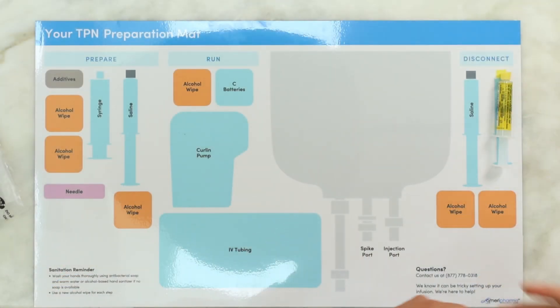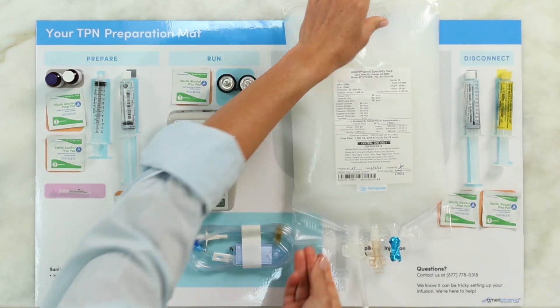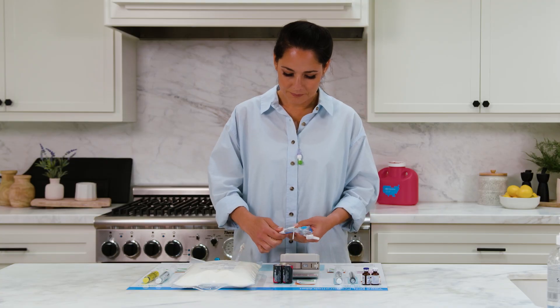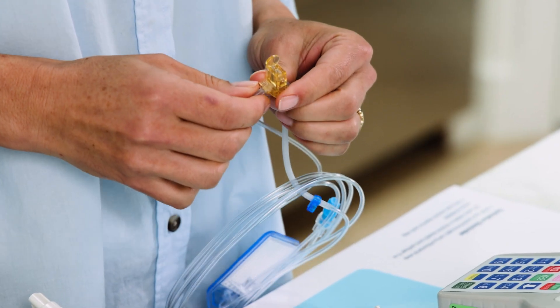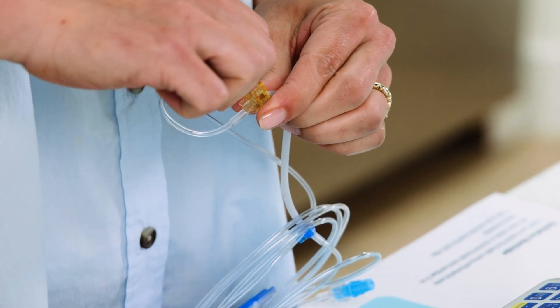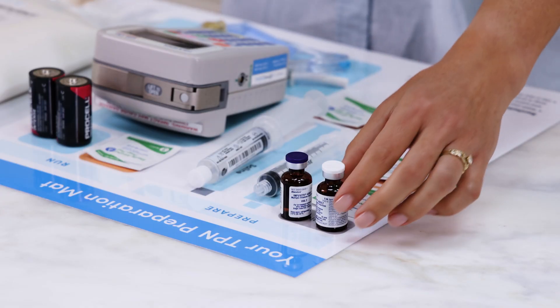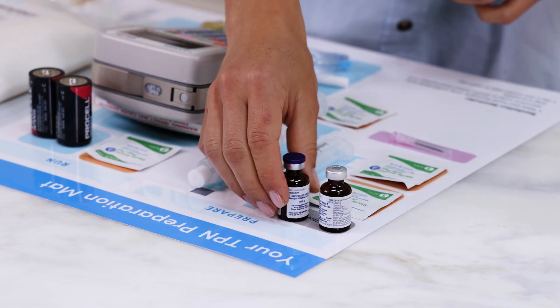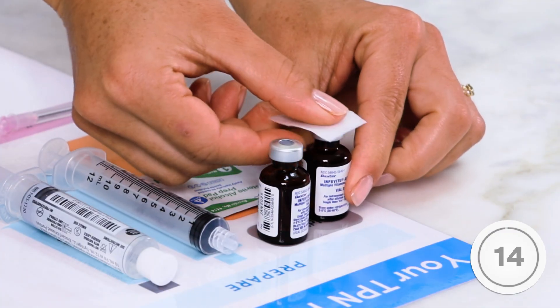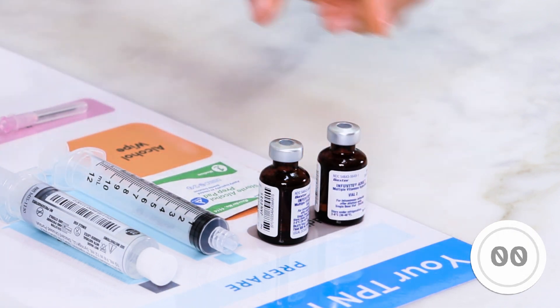Never try to warm the bag up faster in any way. Remove the supplies from the packaging and lay them out according to the pictures on the TPN mat. Make sure to remove the paper wrapping off the IV tubing and remove the breakaway tab off the yellow flow stop on the IV tubing. Remove the caps from both vials. Clean the tops of the vials for 15 seconds with an alcohol pad, using a separate alcohol pad for each vial.